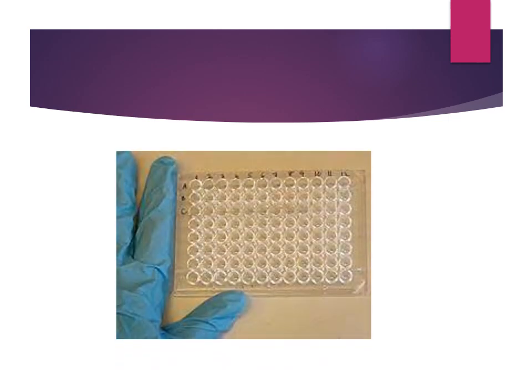Now this is the microtiter plate. You must have seen it in your classes. This is basically what we use for the ELISA, the enzyme linked immunosorbent assay. So this is a microtiter plate, used for ELISA. What is ELISA? Enzyme linked immunosorbent assay.